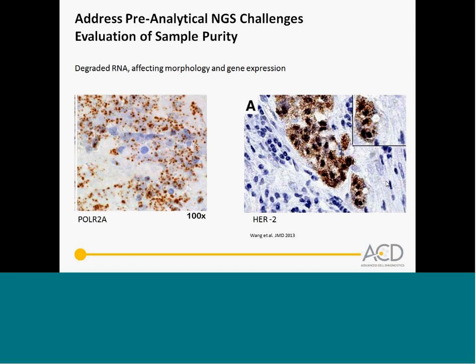And on the right side, you see specifically marked out the HER2 expression. So if you want to select this particular portion for further analysis by other methods, you could knock that out and collect that particular portion of the sample. Next slide, please.